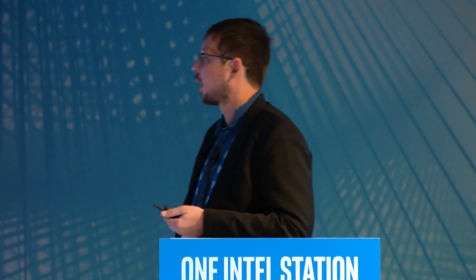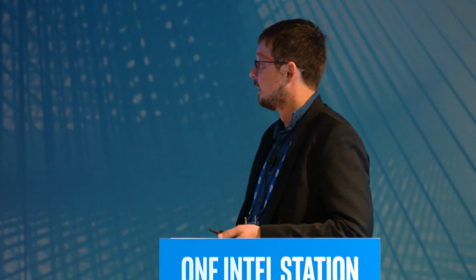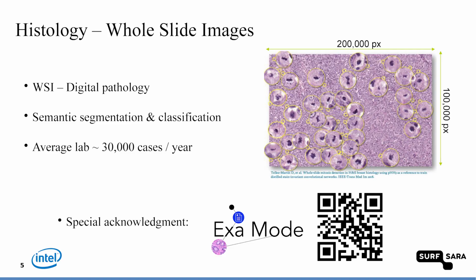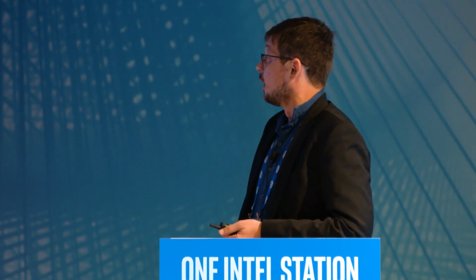So it's quite difficult to analyze patterns in such huge images compared to other types of cats and dogs images you see around. The task here is semantic segmentation. This is the thing that you also see in self-driving cars, where they classify each pixel of a scene, and they say this is a pedestrian, this is sky, this is a road, and so on. For us, the problem is a bit different: we want to see for each pixel if it represents diseased tissue or healthy tissue.